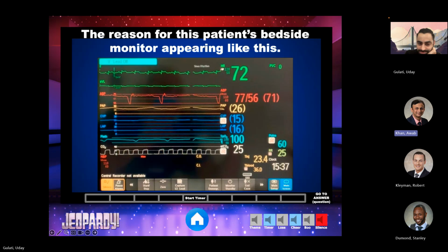So the only thing that would cause that I can think of is like some LV failure, right? Or something like that. Because the heart's still getting the electrical activity, but it's not sending the pressure to the A-line sensor. So for some reason, they're essentially dead for multiple seconds, and then they get a blip of a blood pressure.